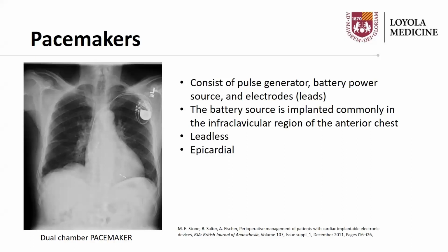And there are also epicardial pacemakers, which contain leads surgically attached directly to the epicardial surface of the heart. These are usually used for temporary pacing following cardiac surgery and then must be removed days following the surgery. We usually see these pacers during CV surgery, and we manage them in our patients in the 2 ICU here at Loyola.